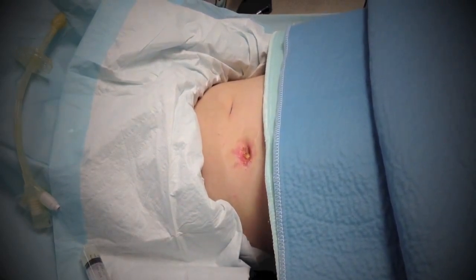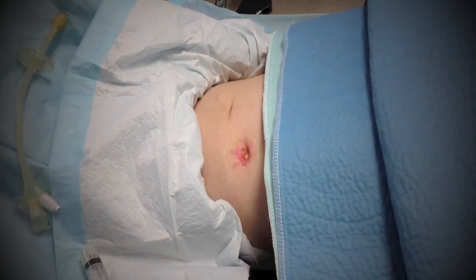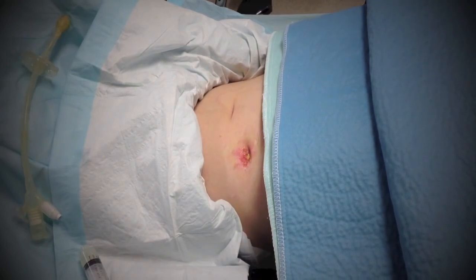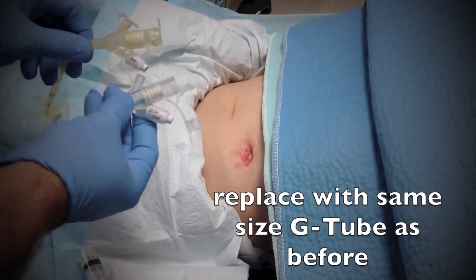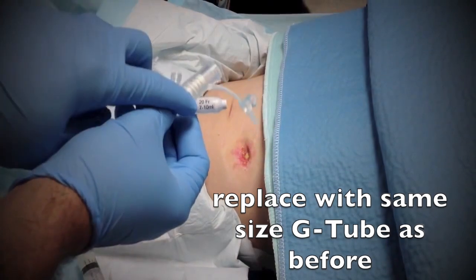Yeah, we had one feeding tube that lasted almost 2 years. Really? It got pretty icky, so we said we're going to take that in, that's too long. For the procedure and for the teaching that we're doing, we always want to replace it with the same size, or maybe even a little bigger size. You never want to go smaller unless you don't have anything else, or unless it's a difficult insertion.